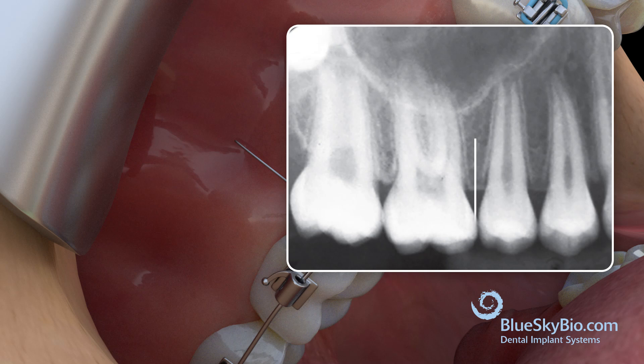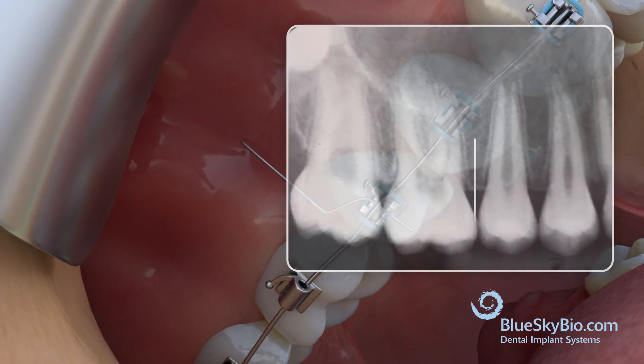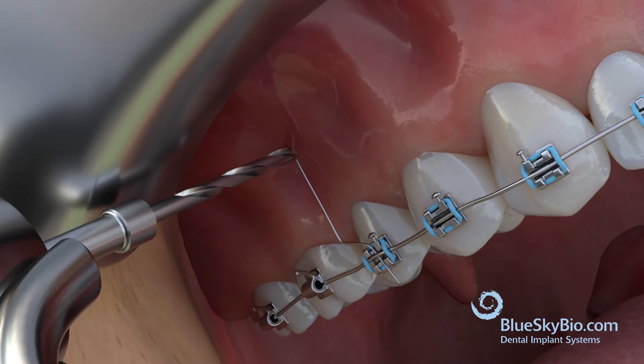Next, take an x-ray to get a clear view of the tooth location and roots. Use a drill to make an initial hole in the cortical bone.